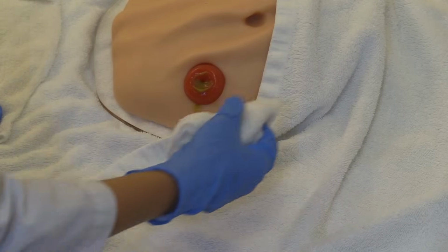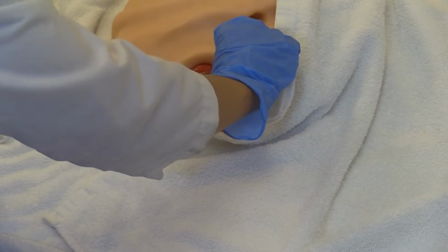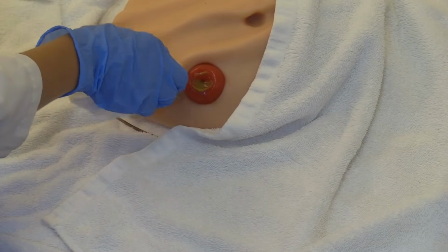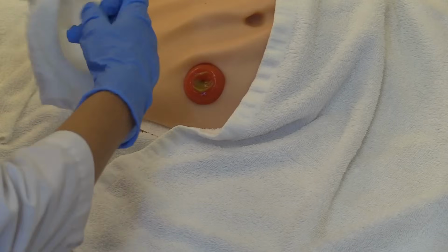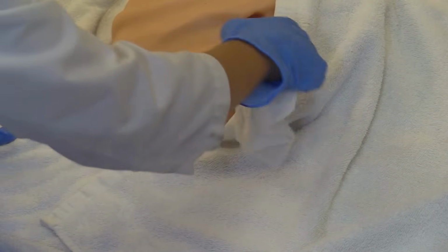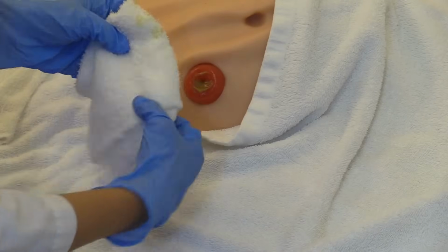And what you'll do is start around the skin and just gently clean the skin, making sure to get any residue off. And then you will clean your stoma.